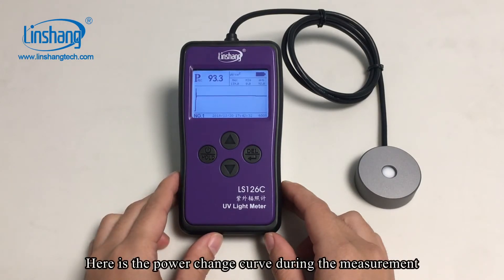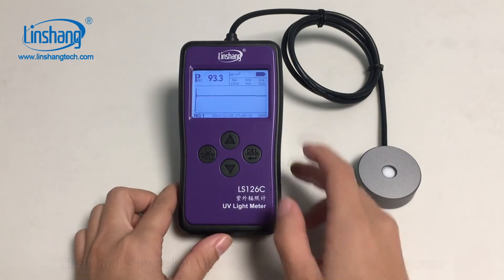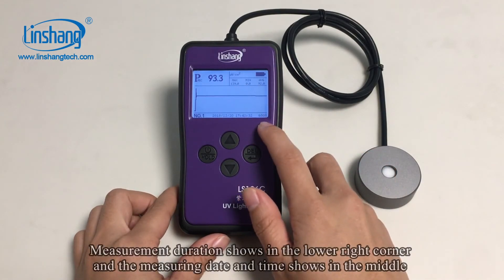Here is the power change curve during the measurement. The P in the upper left corner shows the real-time value of power. The three values in the upper right corner are respectively the maximum, minimum, and average value of the power.